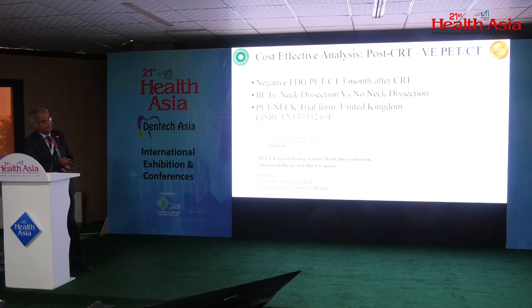Cost-effective analysis in patients who have achieved a post-CRT negative FDG PET-CT 3 months after the chemoradiation therapy. Various randomized clinical trials have been conducted to compare the neck dissection versus no neck dissection in patients who have achieved a negative FDG PET-CT.